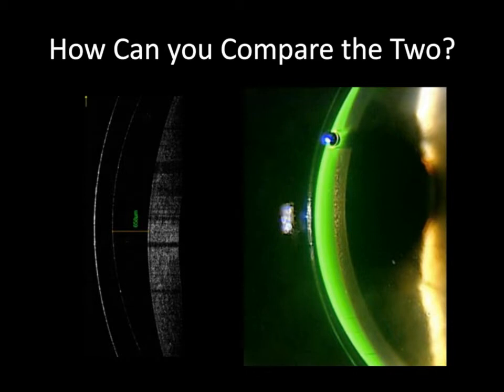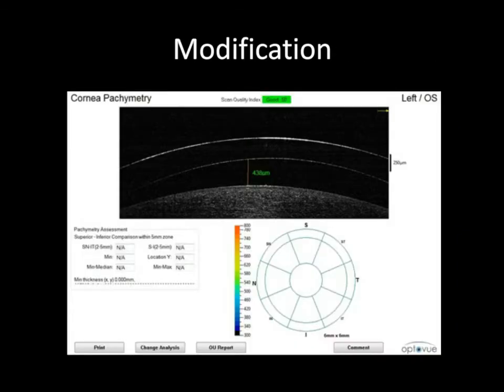It's also important because we're constantly striving for anywhere from 100 to 300 micrometers of clearance. So when you look at these individuals, you can actually see how far off we are from this. And from this individual, I just know exactly how many micrometers I need to sink the sagittal depth. So when you're looking at 438 micrometers of clearance, I need to decrease that approximately 200 micrometers to really get it in the sweet spot.